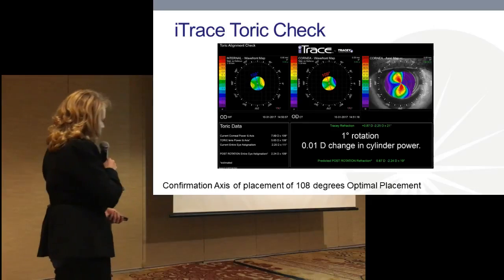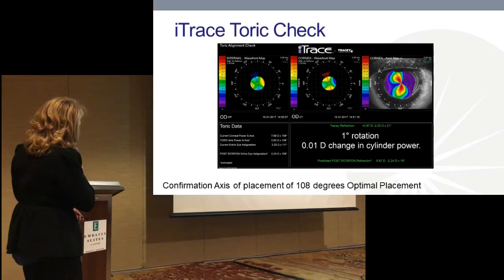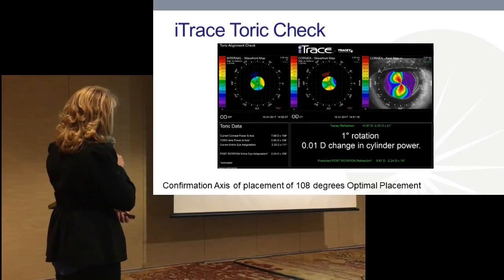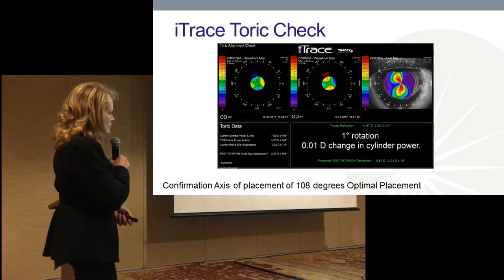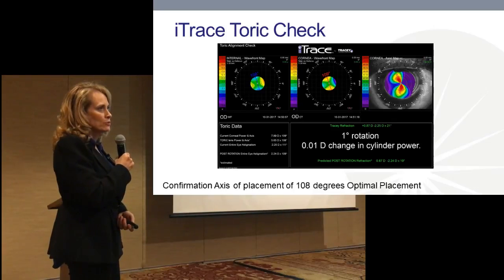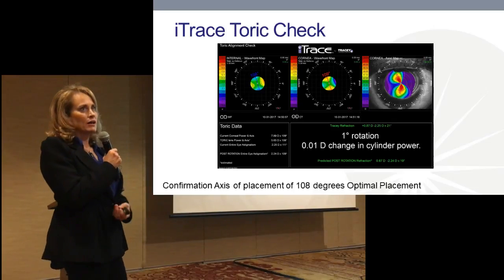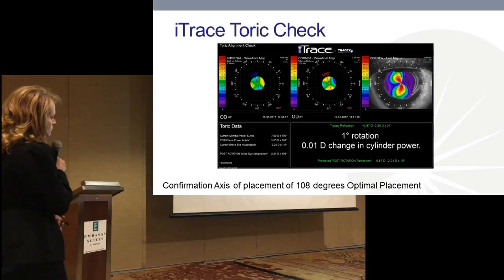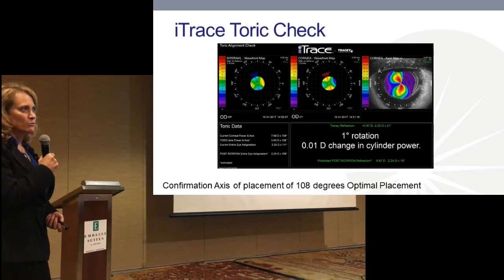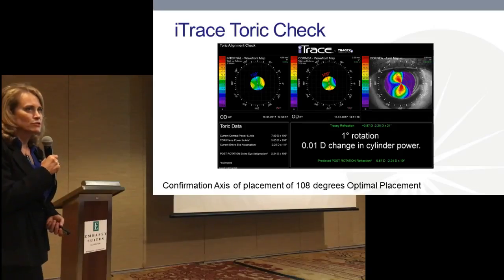One thing that, as I was going through this case with Joe, he pointed out to me that the refractive prediction here on the Toric Check showed that she had maybe 2 1/4 diopters of residual, and that perhaps if we try pushing that for the patient, she may even see better than what we're refracting her at right now. And so now I have a job to do when I go home and try to see if we can get her just a little bit better.